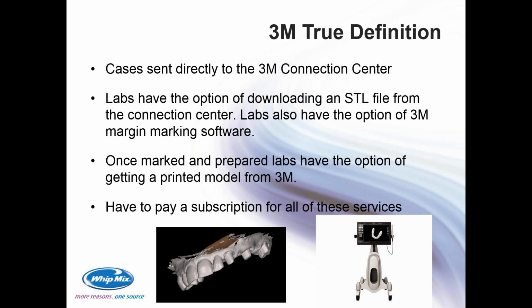And then also to note, you have to pay a subscription for these services. I don't know what that subscription is. When we get to the question and answer, if there's someone who is doing that and would like to share with the group, I'm sure it would be appreciated. I just haven't asked any of the labs that I have that are using the 3M what they're paying, but it is something to note that to be able to even pull down an STL file from the Connection Center, you do have to be part of this subscription.